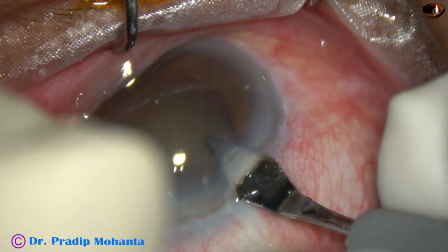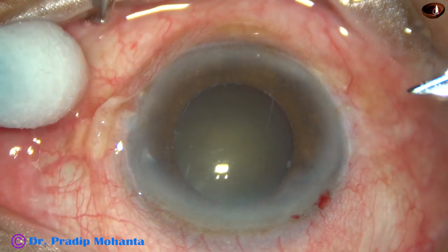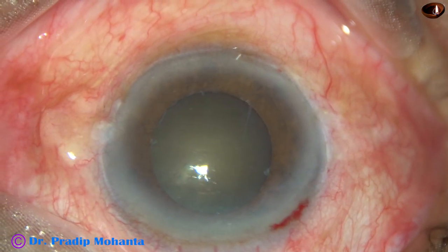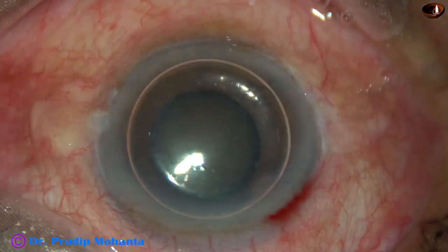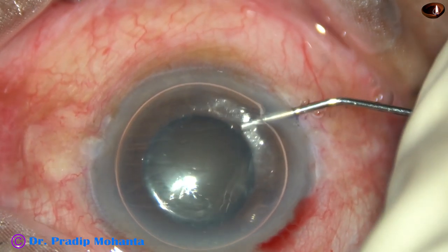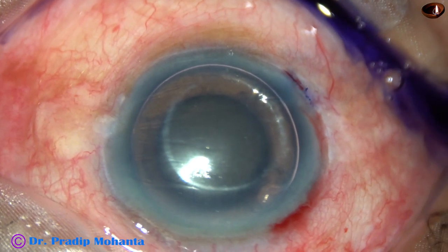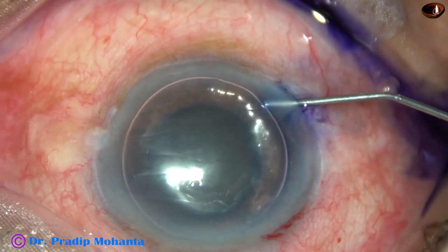Let us observe this surgery. A 2.8 mm main incision has been made. This is a side port on the right side of the main incision, about 3 o'clock hours away. Now an air bubble has been injected into the anterior chamber. My aim is to stain the anterior capsule with trypan blue dye underneath this air bubble.